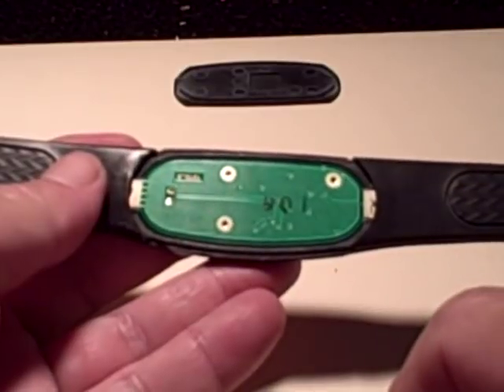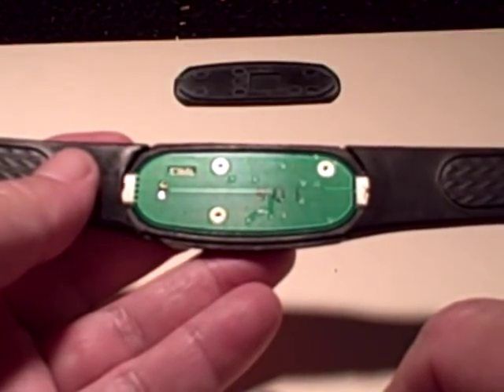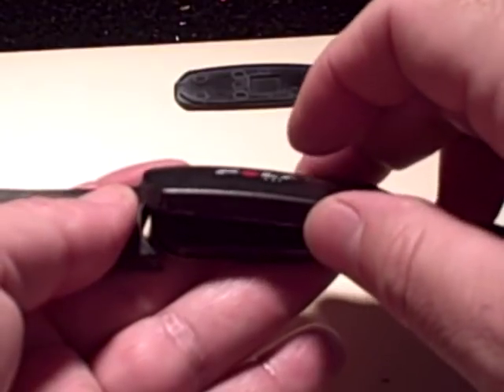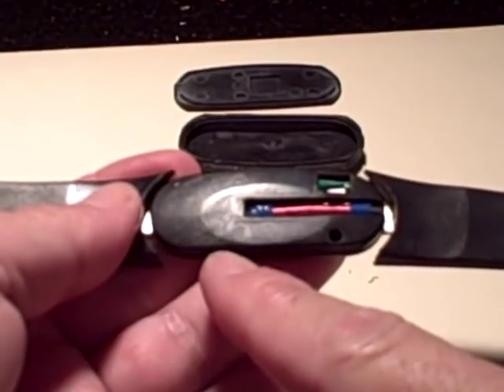There are three screws here — I've already taken them out. It takes a small jeweler's or eyeglasses screwdriver to take them off. And the battery is just on the other side. The front cap can come off as well.